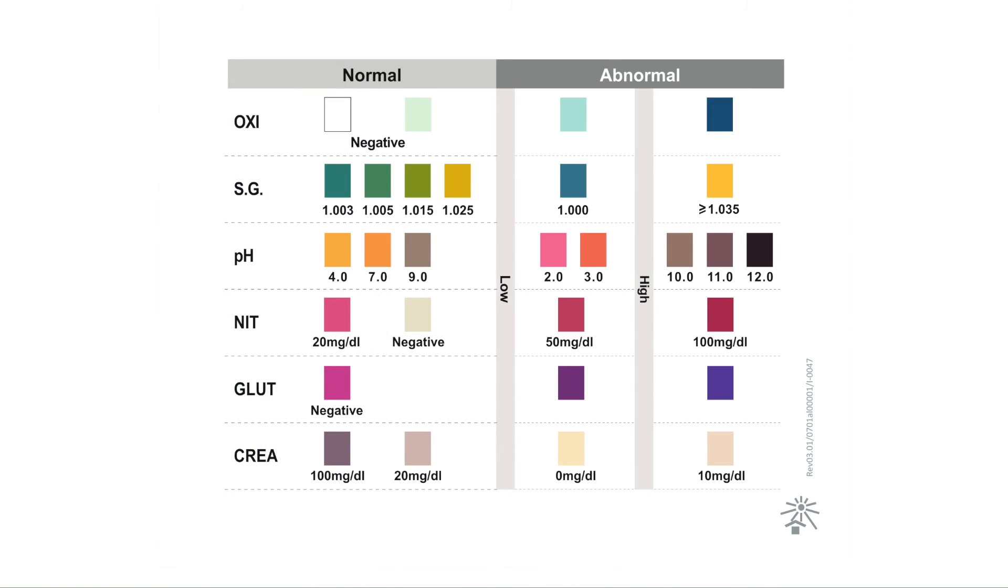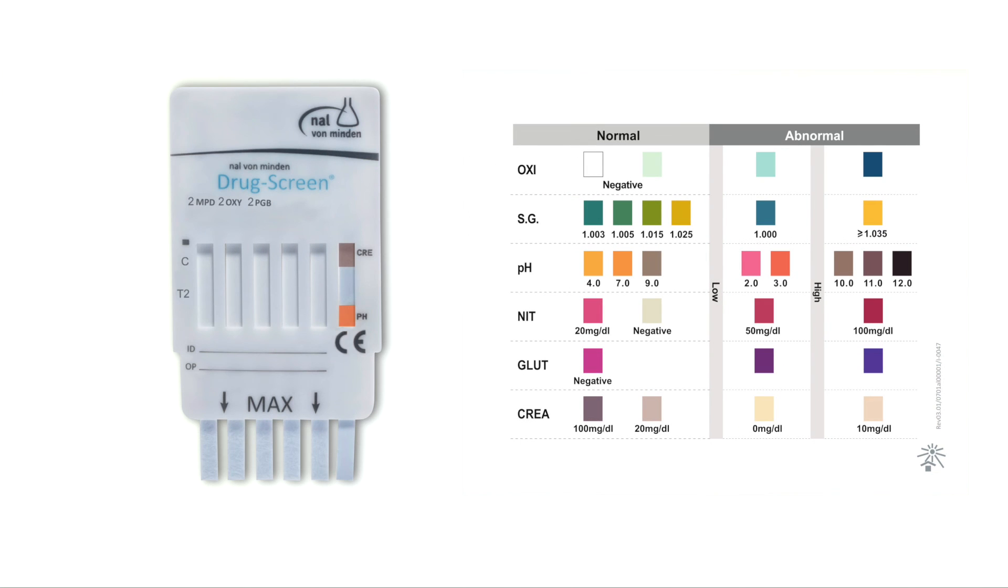The result interpretation of adulteration parameters is done using the enclosed colour card. Compare the colour of the test fields with the corresponding fields on the colour chart and read the result.